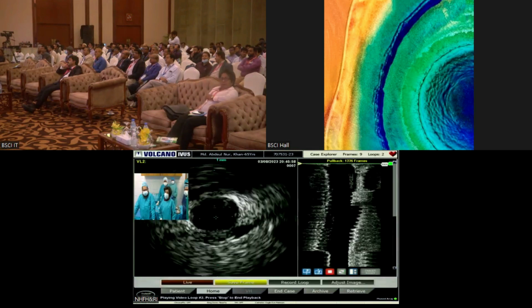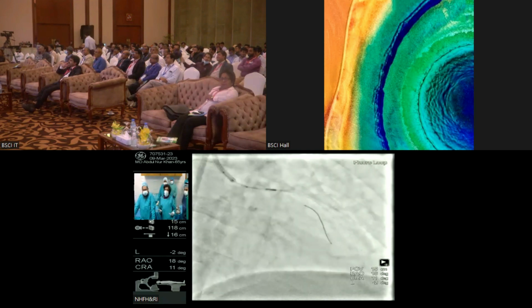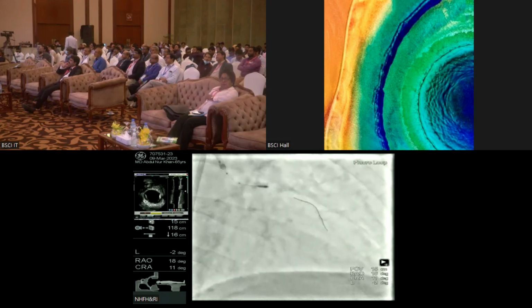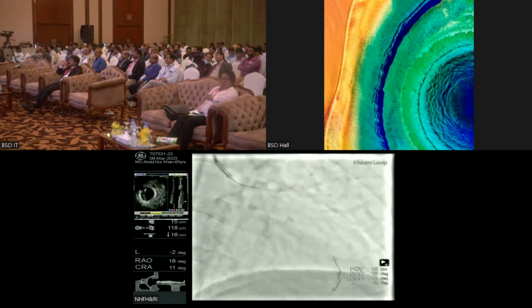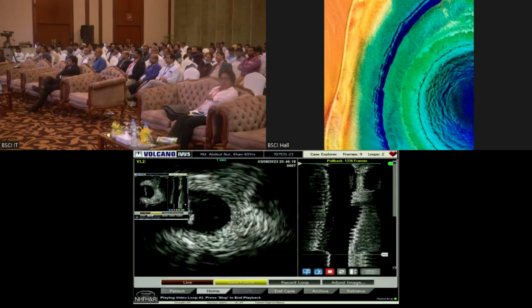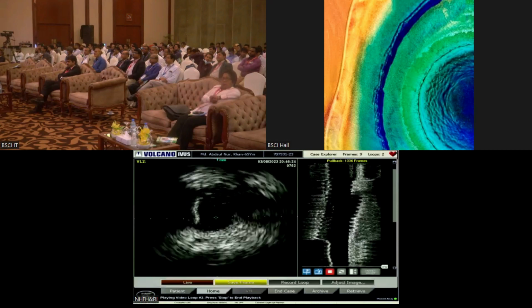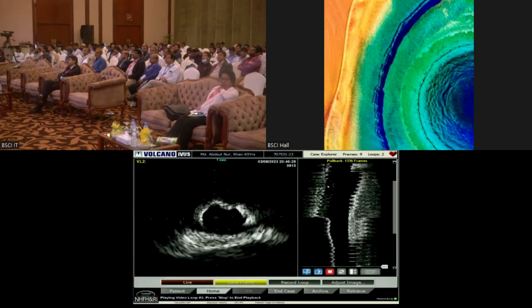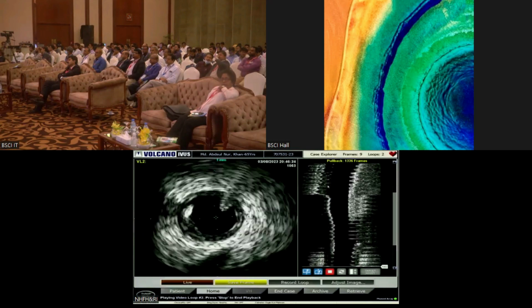At this point, we wired our LCX, and this is where you have us. After wiring the LCX, we were waiting because we didn't do any pre-dilatation. What we've done up till now in this gentleman is a rota from left main to LAD with a 1.75 millimeter burr, and we've wired the LCX to OM1. As you can see, the plates of calcium have thinned out somewhat, and there are some cracks and fractures as well. So that's us up till now.